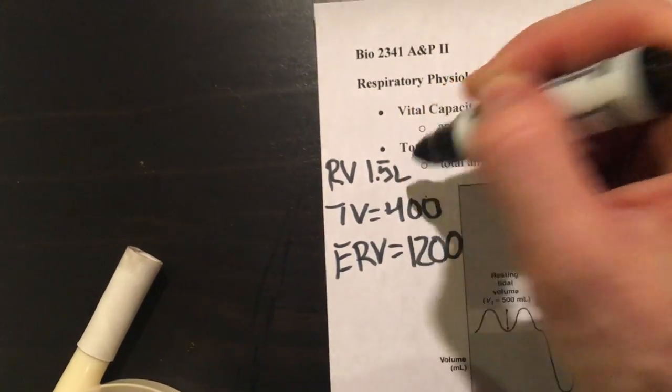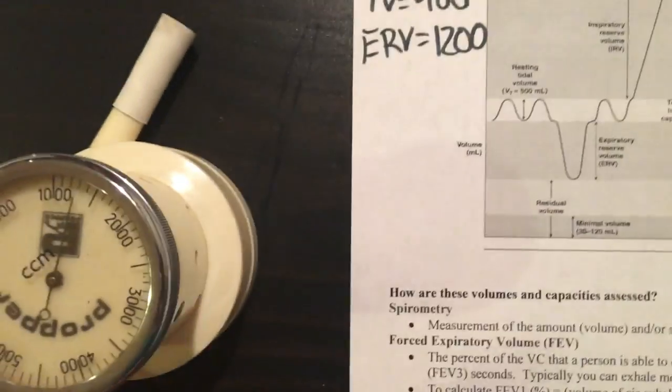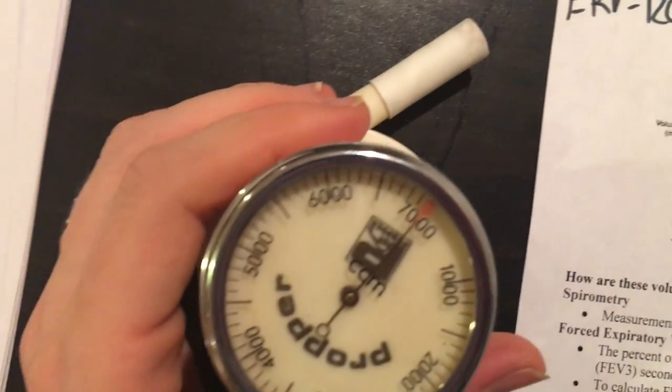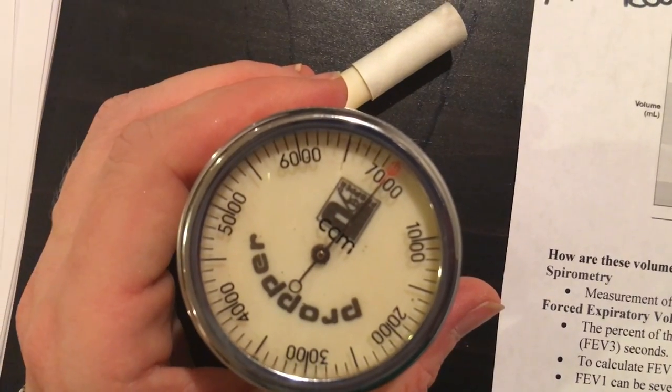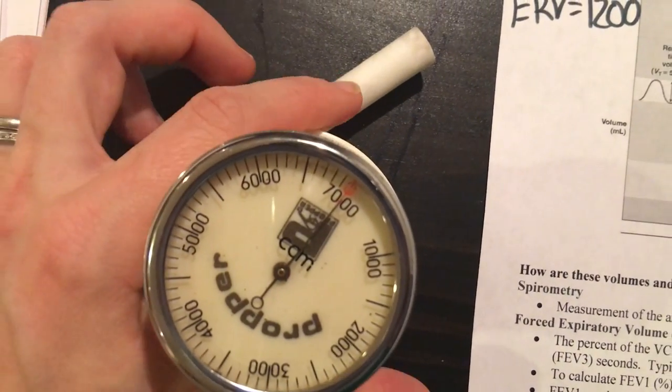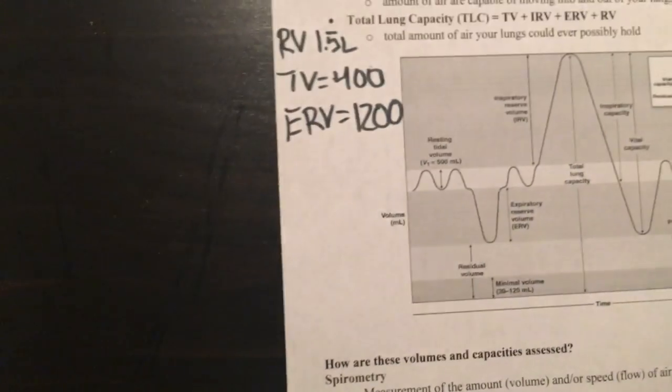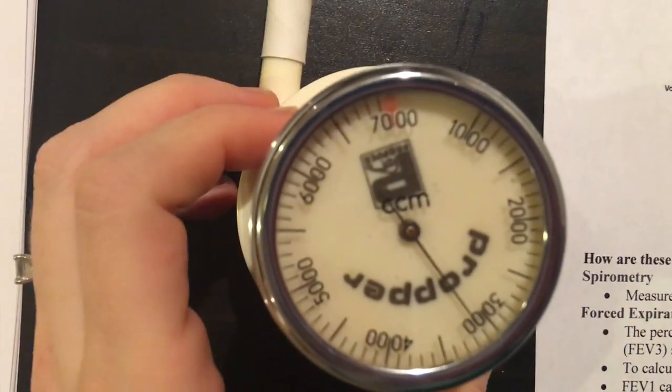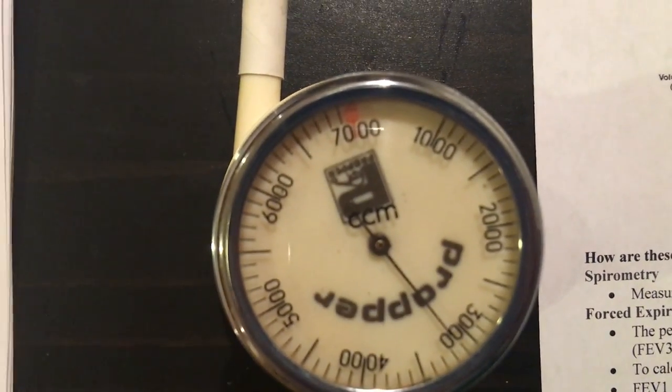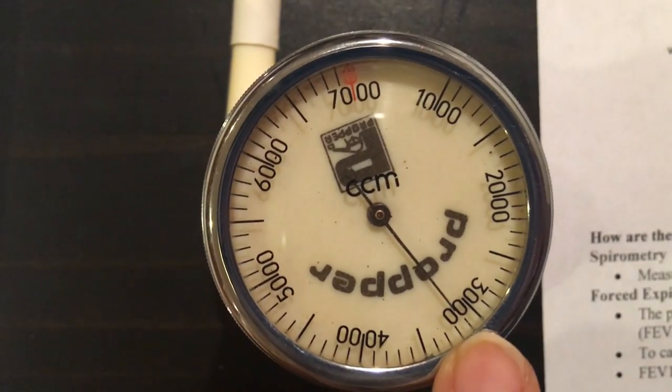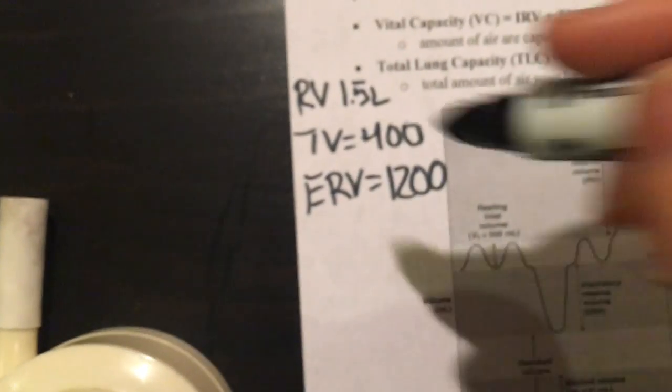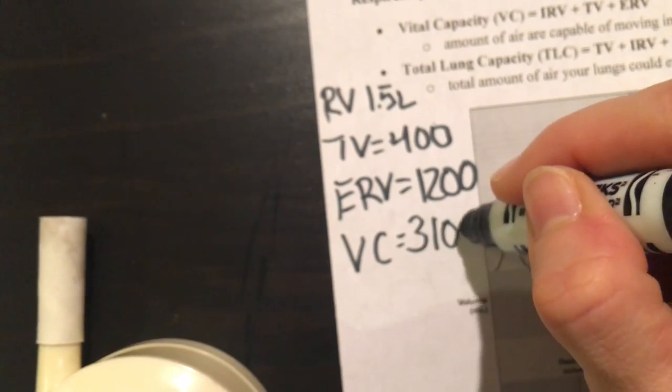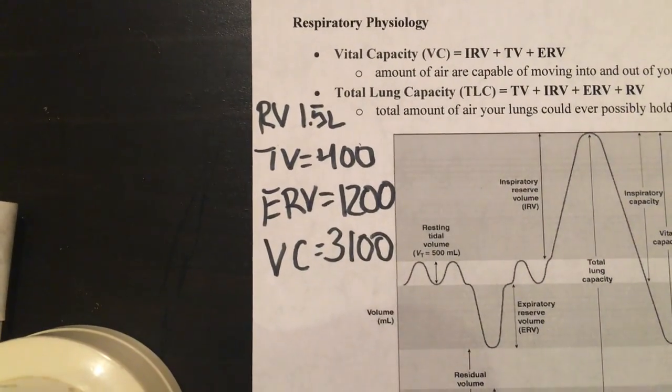Let's take the vital capacity now. Reset the spirometer to zero. We're set to zero again. Now I'm taking a deep breath and then I'm going to exhale completely into this tube. All right, not bad. So we went from zero to that, that looks to me like 3,100 milliliters. So vital capacity was equal to 3,100 milliliters for me.